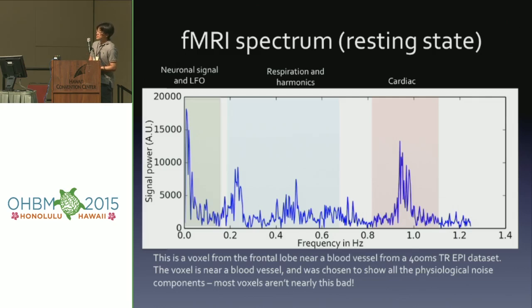You can clearly see the peak of the heartbeat right here around 1 hertz, and the peak here, which is the respiration, and several harmonics of the respiration.